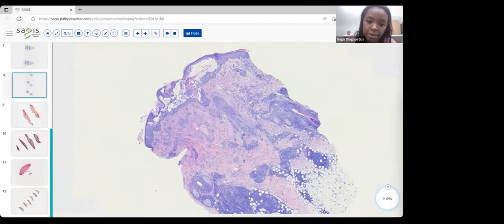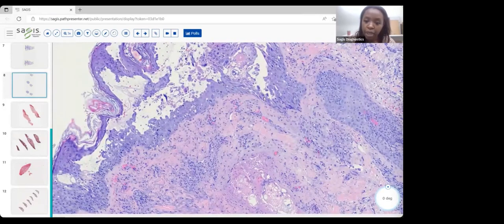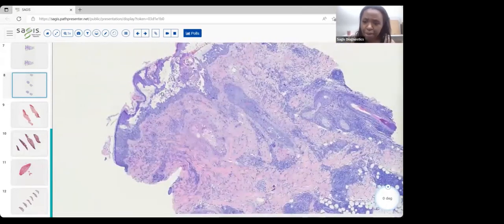And all the layers of the epidermis can be affected. So you can get breakdown and involvement with viral infection all the way to the basal layer. These cells burst, releasing the viral particles into the dermis, and you get this robust inflammatory reaction. You have polys, you have a full and profound inflammatory reaction possible, okay? So that's the first thing. We already talked about the different kind of cytopathic effect with the margination, multinucleation, and molding.